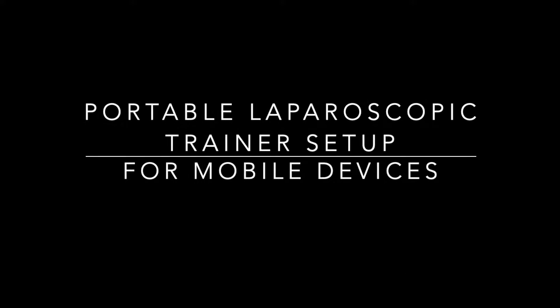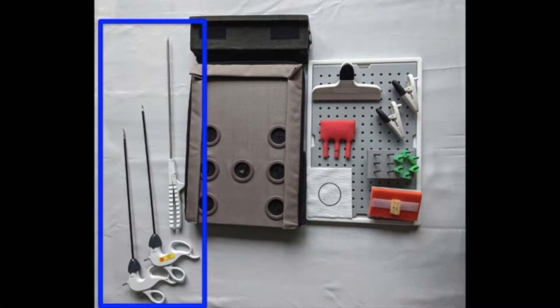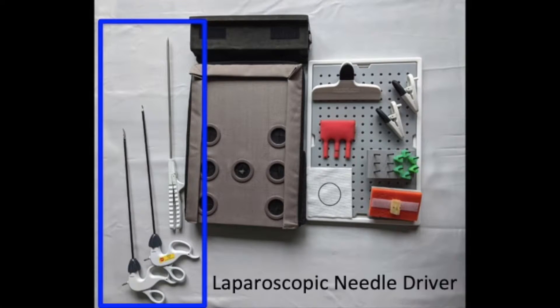To set up the portable laparoscopic trainer for mobile devices, here are the supplies that you will need. The minimum instruments required are laparoscopic scissors, graspers, and needle driver.